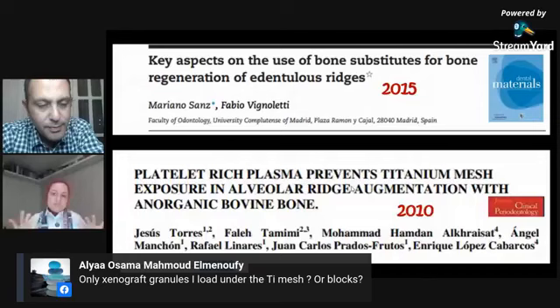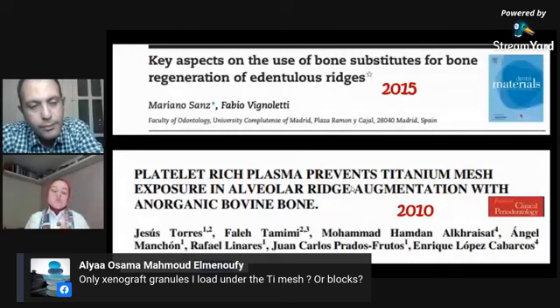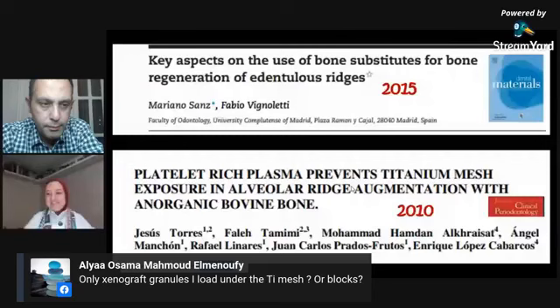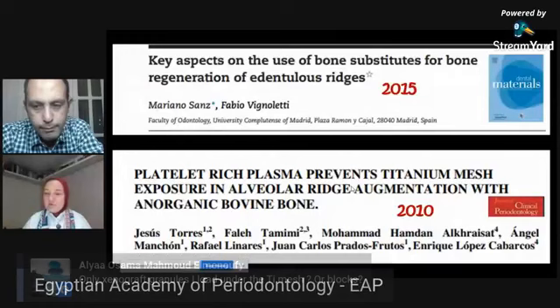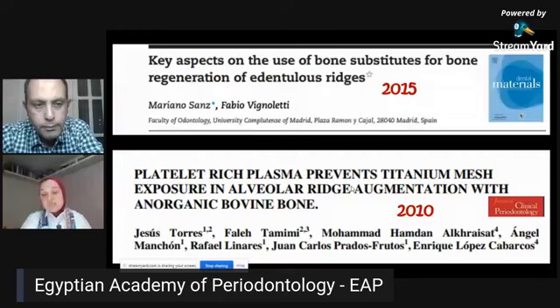Usually what you do with the block, as we're going to explain in the next case, is that you just place the block, and if you are concerned about the resorption of the block, you may use a collagen membrane just for protection or maybe some particulate overlying, but you don't have to use something as tough and space-making as the titanium mesh. If you think about it, this will make a huge augmentation area. Imagine putting a block and then covering it with titanium mesh. You will never have enough soft tissue to close above everything. So no, I never see titanium mesh with a block. If you use a block, you just put the block alone and maybe put some particulate xenograft or alloplast or whatever overlying it, like the case we're going to see right now. Did I answer? Yes, sure. Okay.